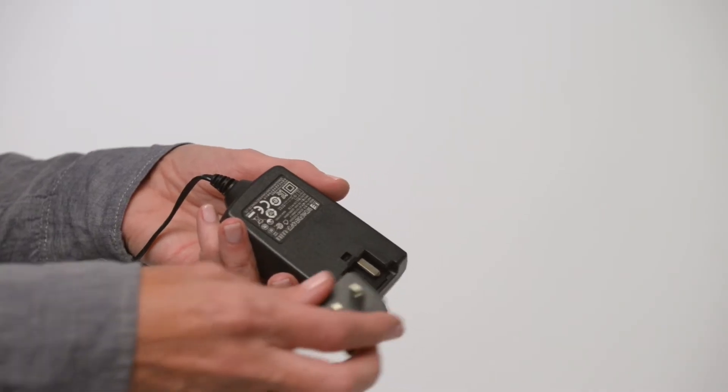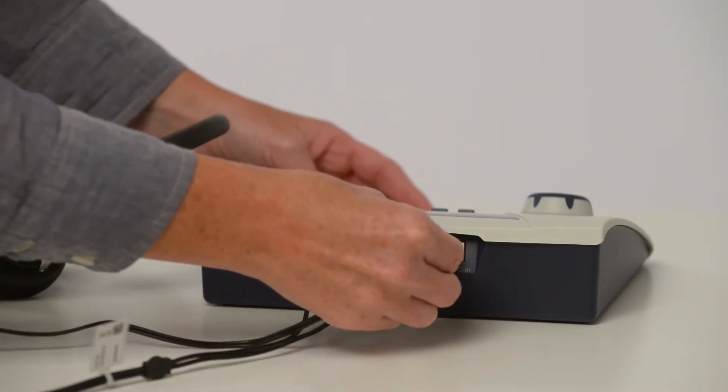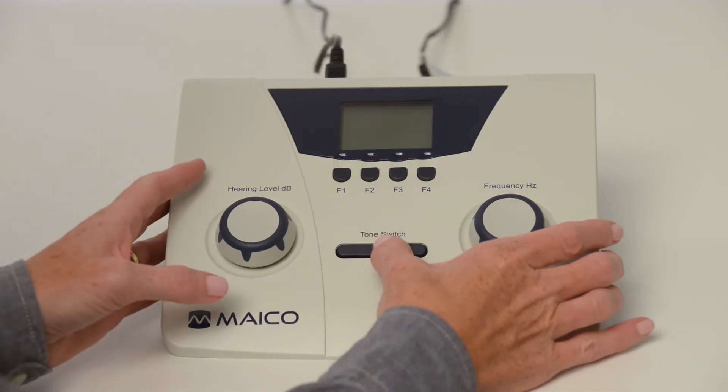Attach the plug onto the AC adapter, making sure it is pushed all the way down until you hear a click. Connect the power cord, then turn on the device.